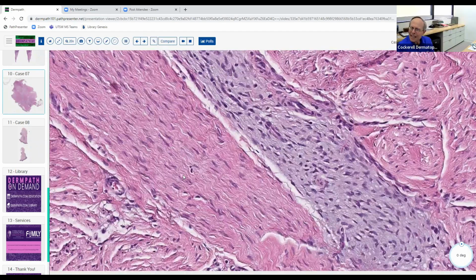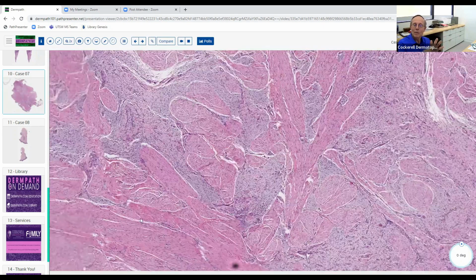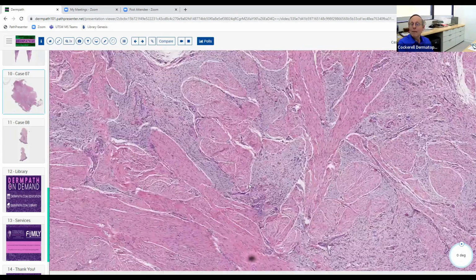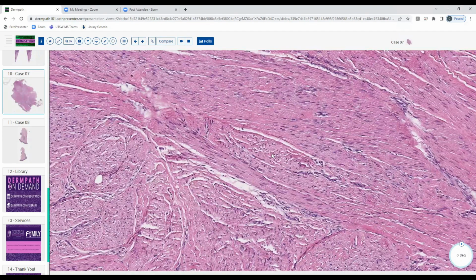Well, that would be a fat lesion. Remember, we're in the fibrous lesion. Maybe a fibrous histiocytoma? Well, that's a possibility. A fibrous histiocytoma is fibroblasts and histiocytes, like a dermatofibroma. Clearly, it's got a fibroma component, right? So part of what we just say is just fibroma.